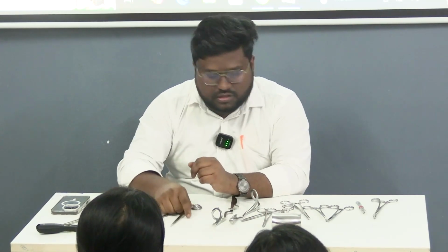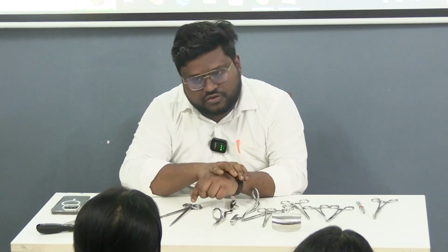ঠিক আছে? These are your cesarean set. এই পুরো জিনিসটাকে বলা হয় cesarean trolley বা cesarean set. Okay? Anything else? That's about it. Any questions for cesarean? কি বুঝতে পেরেছিস?